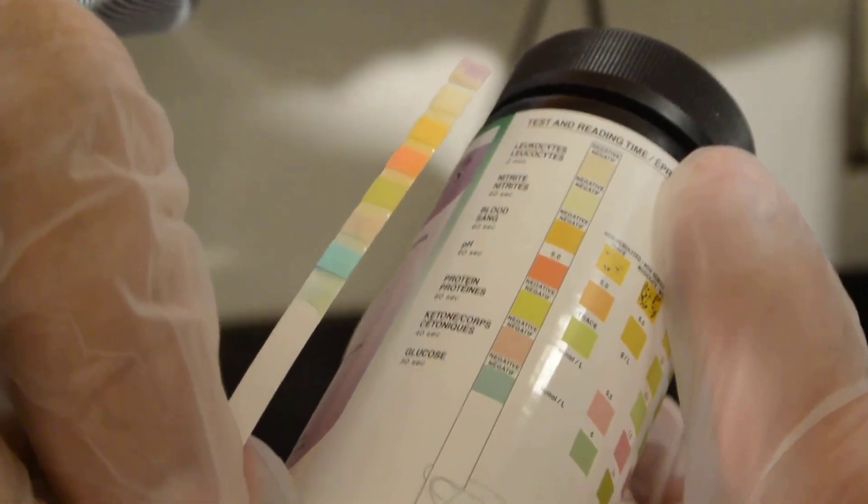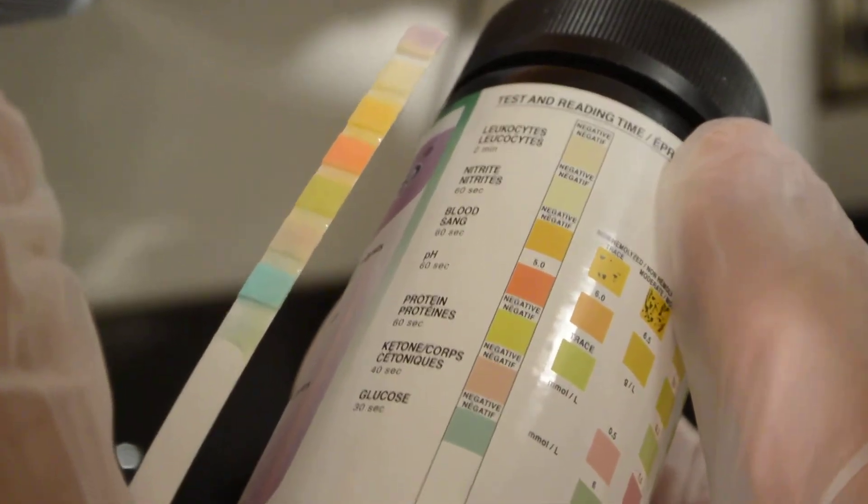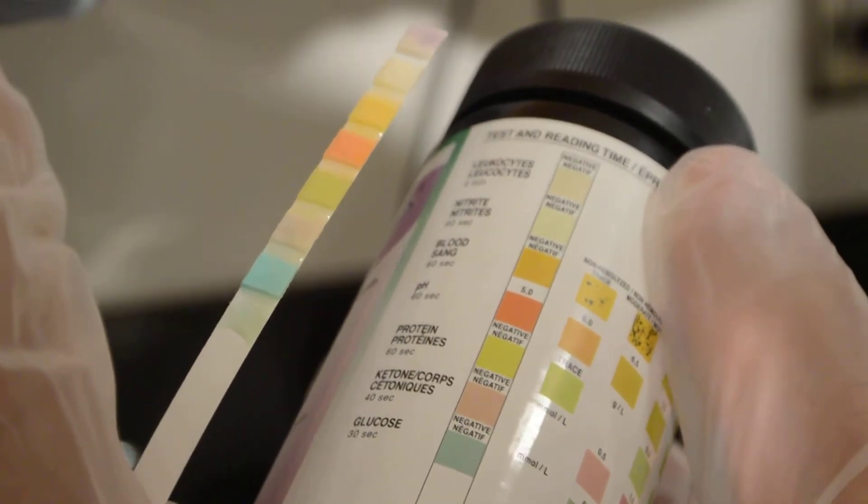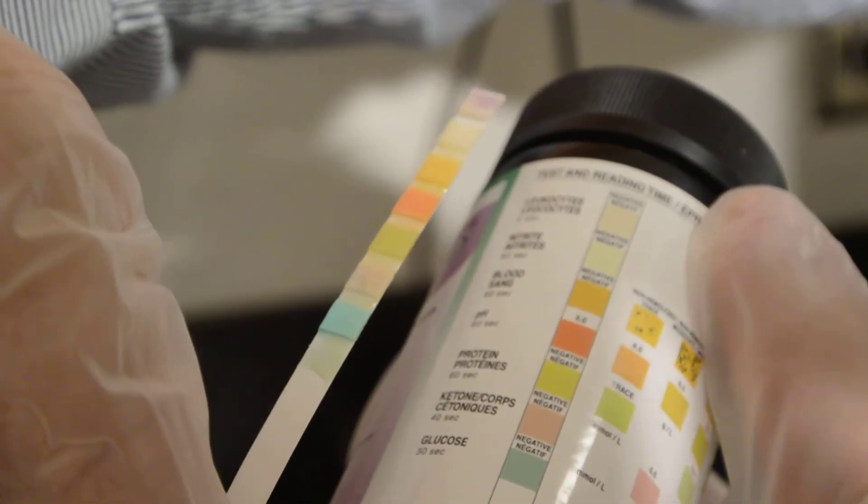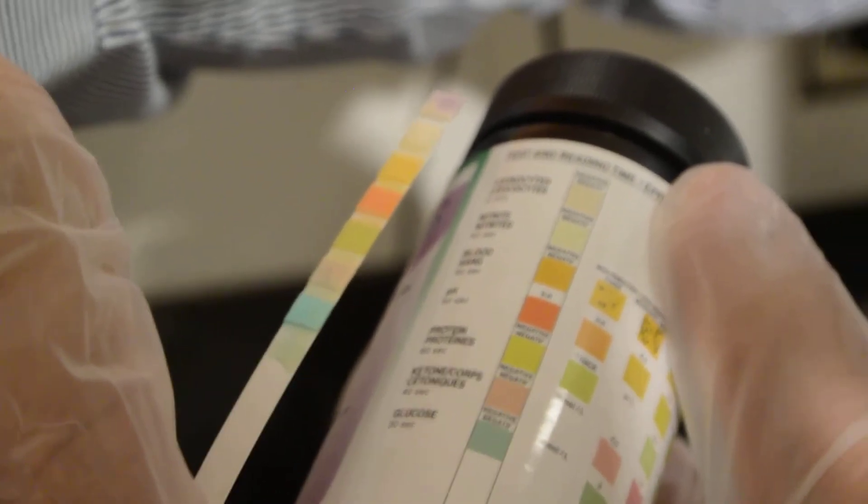We won't really go into the detail of how to read the result. You can just compare it to the guide, but this gives you a good idea of how to appropriately do a urinalysis test.